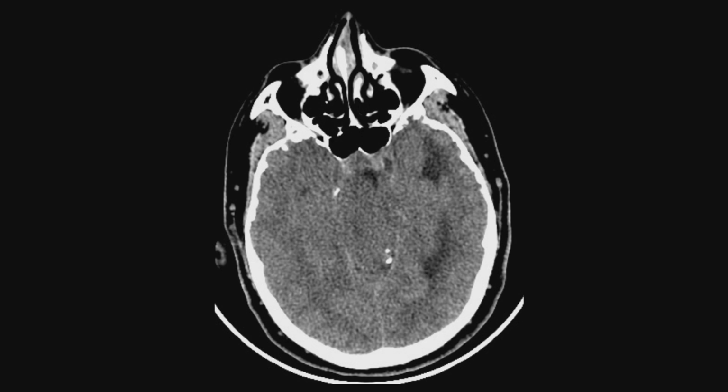His first study was performed on November 3rd of the last year, and we began with a simple skull tomography. In this slide, we can demonstrate a decrease of the amplitude of the subarachnoid space, which corresponds to edema. I know it is not the right window, but however, we can observe bone erosions in the anterior and middle cranial fossa.